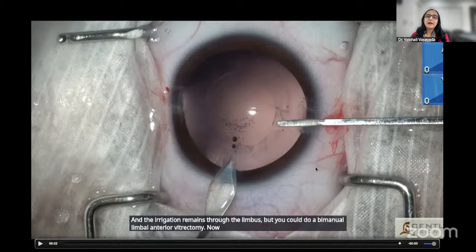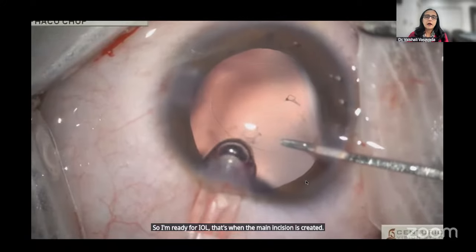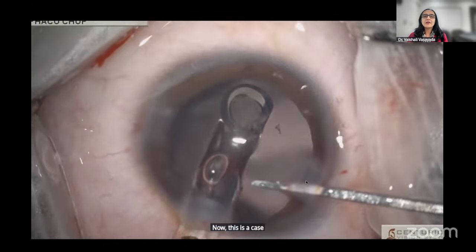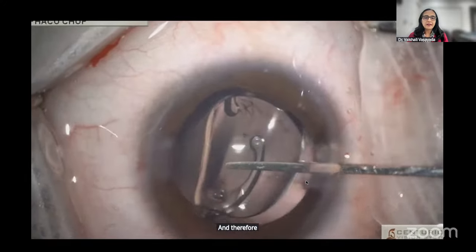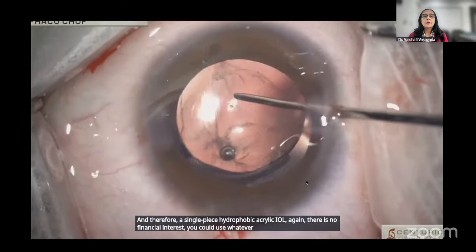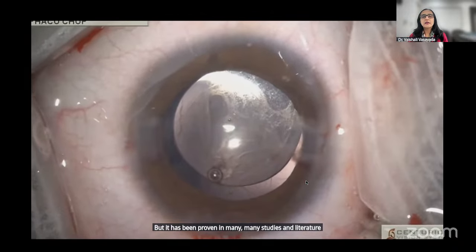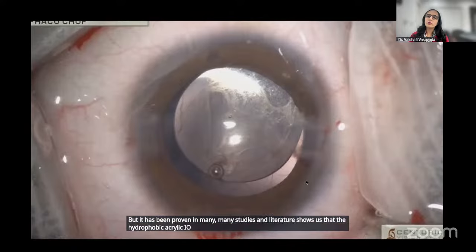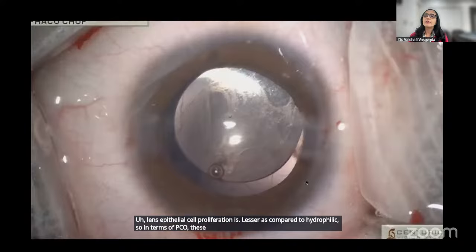Now, only once I'm ready for IOL, that's when the main incision is created. Now, this is a case where an in-the-bag IOL implantation was performed, and therefore a single-piece hydrophobic acrylic IOL. Again, there is no financial interest. You could use whatever you prefer, but it has been proven in many studies and literature shows us that the hydrophobic acrylic IOL is both uveal tissue friendly as well as lens epithelial cell proliferation is lesser as compared to hydrophilic. So in terms of PCO, these lenses are preferred in younger children.